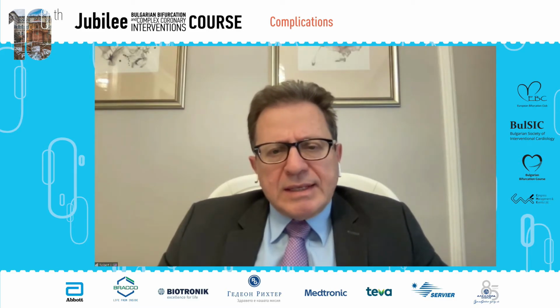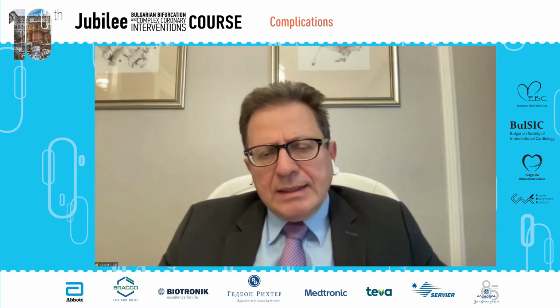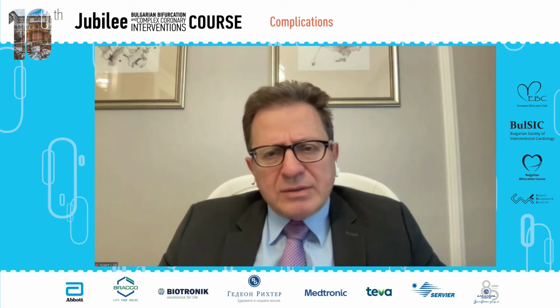let's say repeat the angio for a fresh assessment. Good suggestion, yeah. And taking into account, let's say, one more attempt, but as I told you, with the best in the group. I mean, the CTO operator, taking into account much more sophisticated tricks and devices.